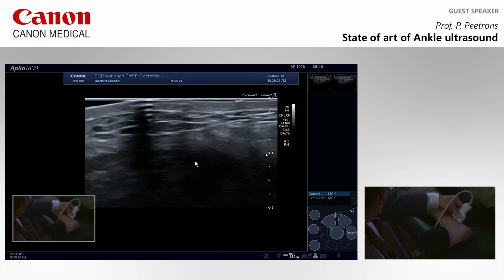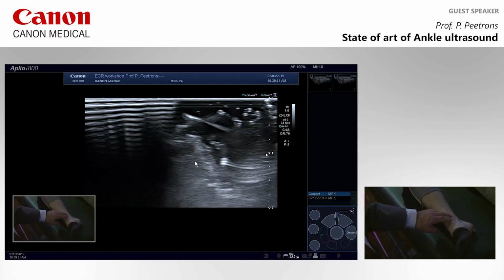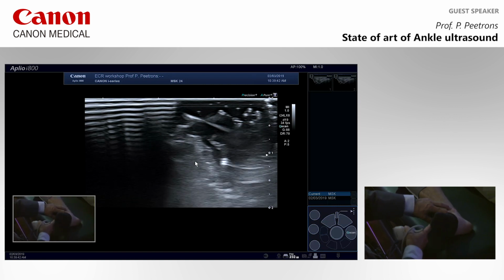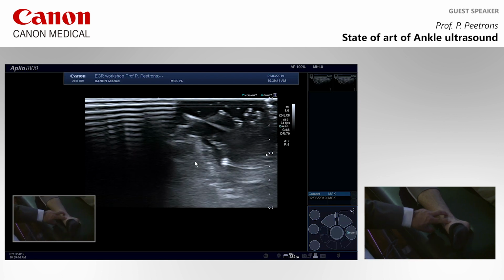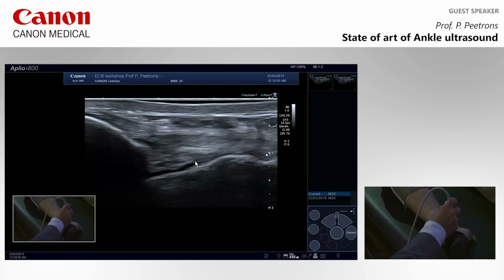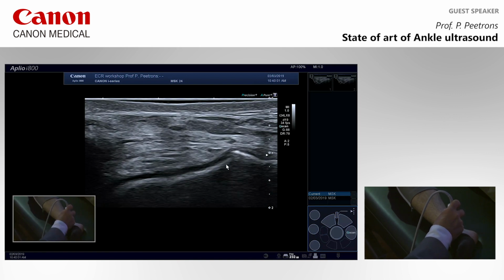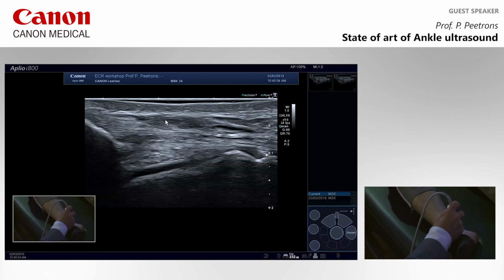It is exactly the same for the anterior part of the deltoid ligament. Okay? So when you are looking to the anterior tibiotalar or tibionavicular ligament, what is the good position? Is it like this or like that? Of course it's like that, okay? Because you open the gap between the navicular bone and the tibia. So if you want to see the anterior tibiotalar ligament, you have to open the gap between the tibia and the talus. So here is the talus, anterior part of the talus. Here is the tibia.